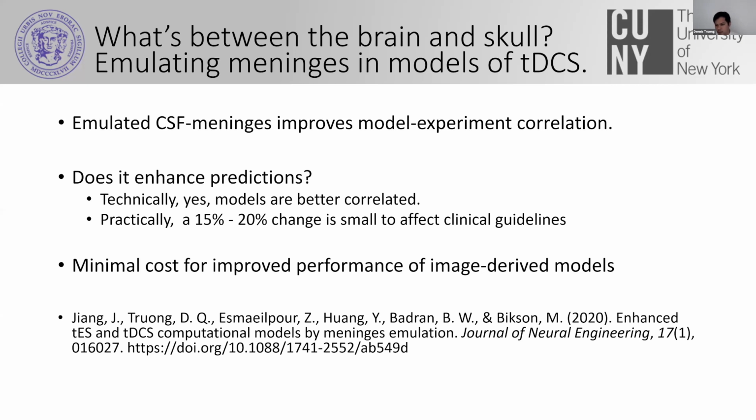So it's an approach that we suggest most TES modeling pipelines could take. We suggest that we can lower the CSF values from what's currently used in most places, 1.6, to about 0.85, just so they take into account some of these partial volume effects.